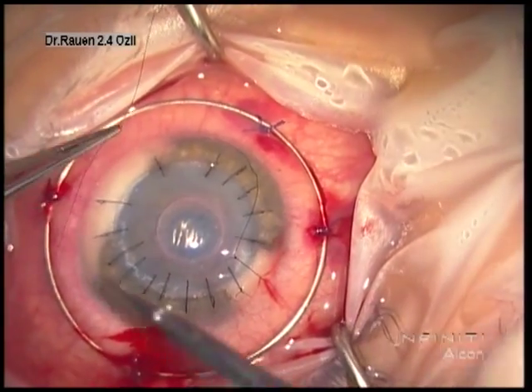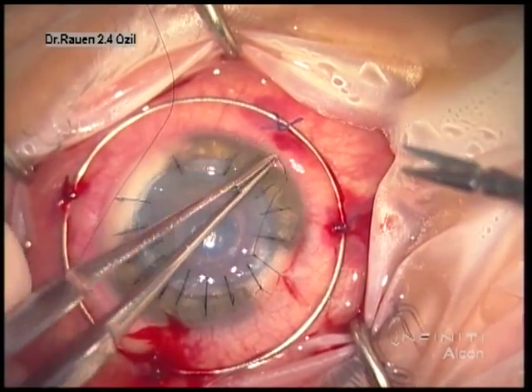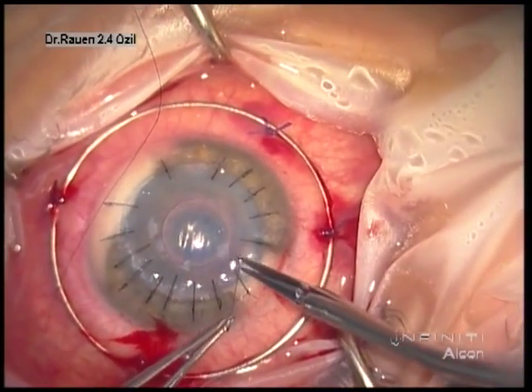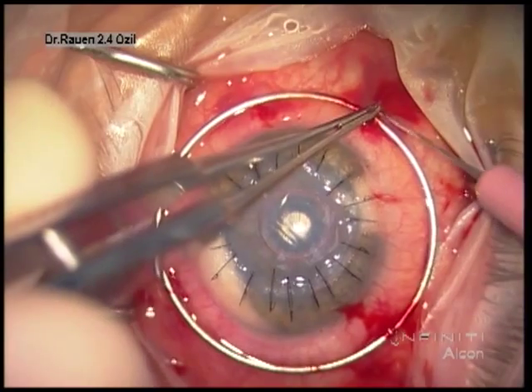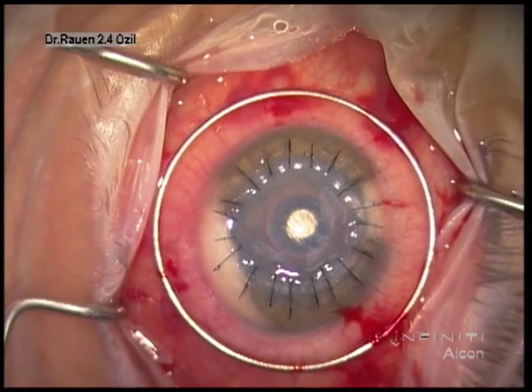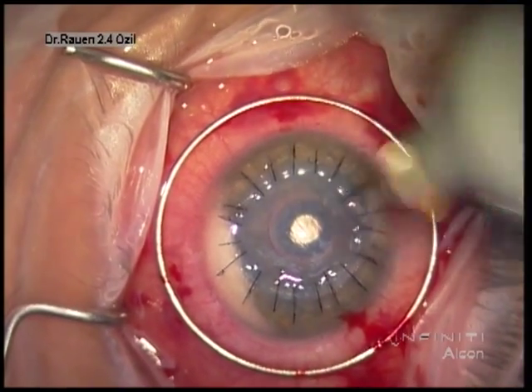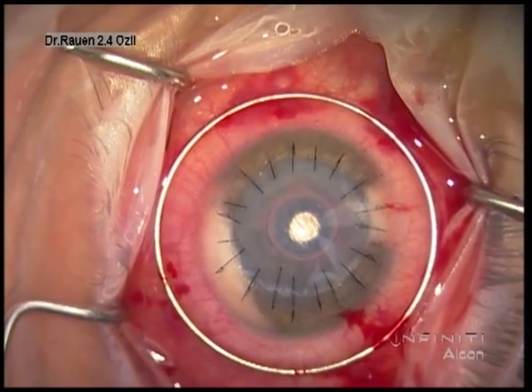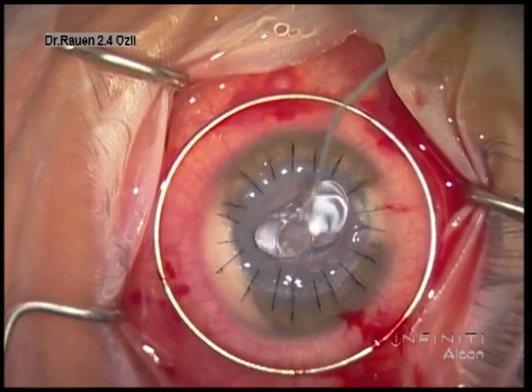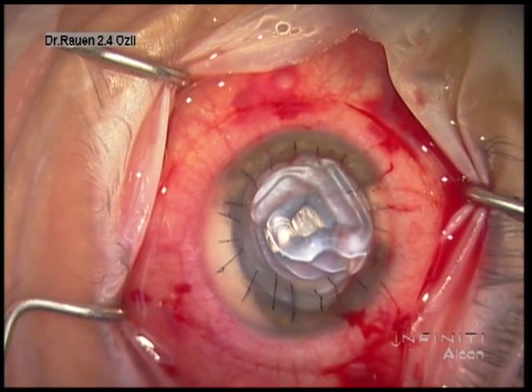At this point most of the suturing has been completed. Of course, all knots would be buried. To conclude the case, we remove the stabilization ring and place ointment on the surface of the eye. Again, this is a very rewarding technique as it avoids the issues of endothelial rejection and allows patients to get off drops much earlier. Thank you for your attention.